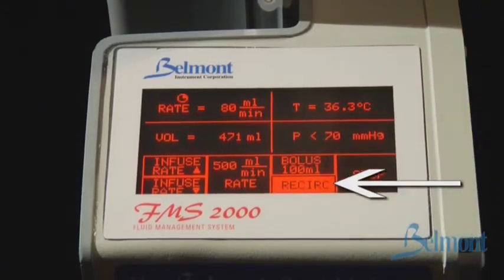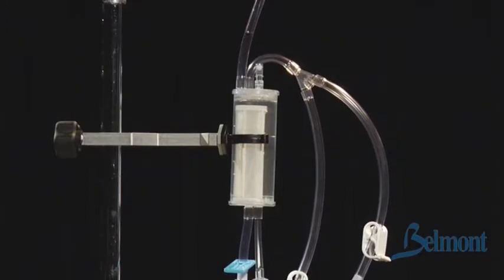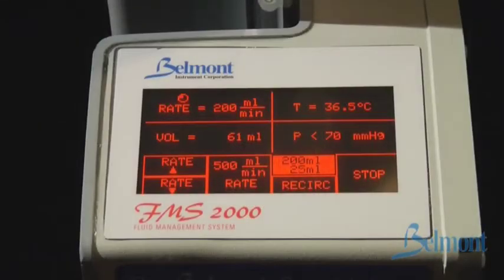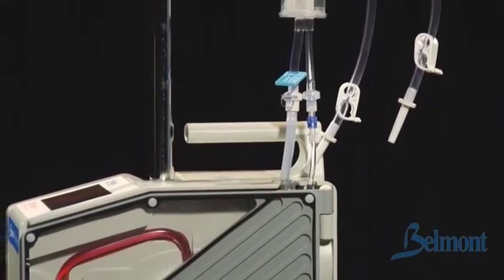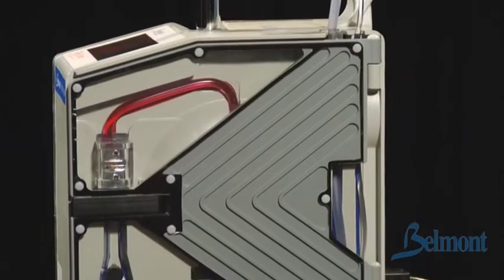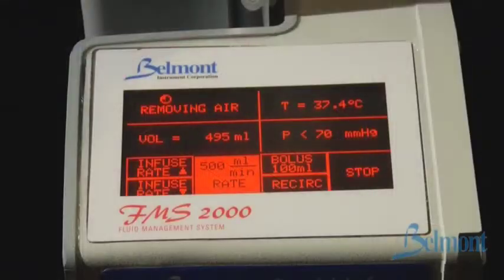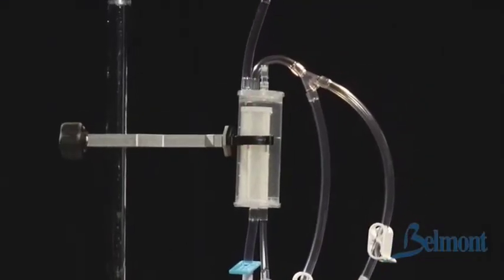Pressing the recirculation key will recirculate fluid through the reservoir and disposable circuit. It is used to warm and mix fluids. Recirculation pumps fluids at 200 milliliters per minute and will automatically stop after 5 minutes. As fluids are warmed, gases are formed. The Belmont Rapid Infuser will trap these gases within the system and automatically purge them out to the atmosphere. When this occurs, 'removing air' will be displayed on the screen and you may see bubbles escape through the recirculation or vent line.